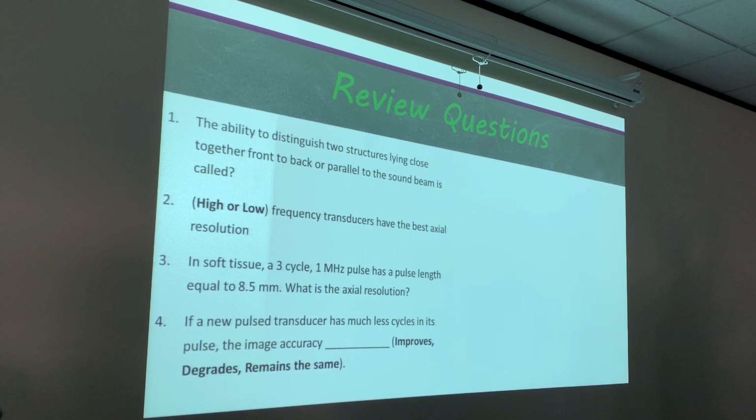I'm waiting. I have 4 more, right? Are we voting? No, we're not voting. I'm waiting on my synonymous terms. Axial resolution. What else? Longitudinal. Axial. Range. We already said axial. Radial. Range resolution. Okay. Those are our synonymous terms for axial resolution, along with depth.